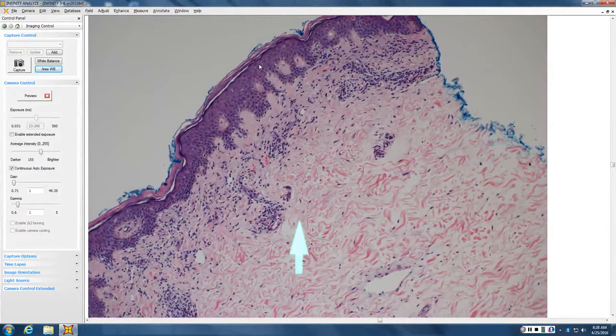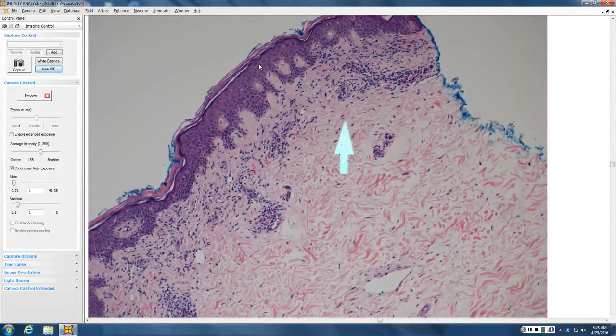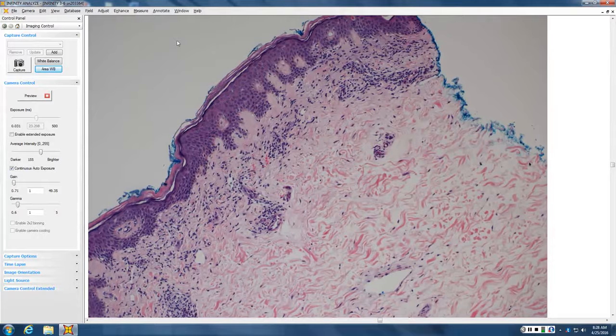So it looks like there's a superficial infiltrate, predominantly lymphocytic, maybe some histiocytes as well. And is there anything at the junction happening? It looks like there is some mild interface. Just a little bit of interface. And is it lots of sites of damage out of proportion to lymphs, or is it sparse but a lymph in every hole? Sparse but a lymph in every hole.